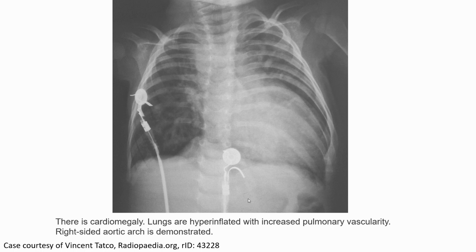Here is another case of truncus arteriosus. We can see cardiomegaly with lung and high pulmonary vascularity with increased pulmonary vasculature. The right-sided aortic arch is demonstrated.